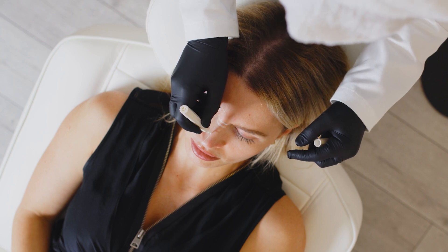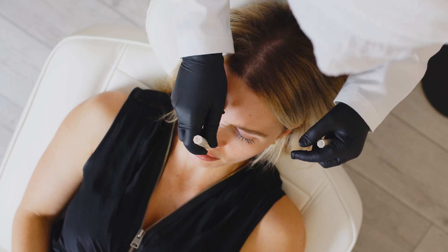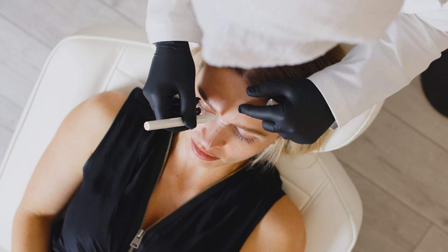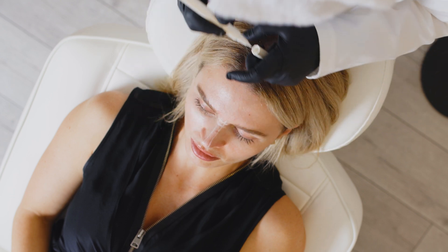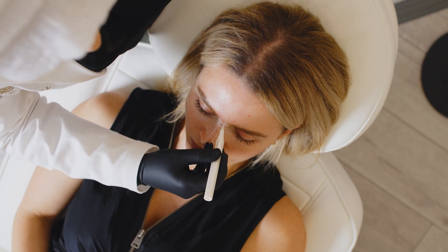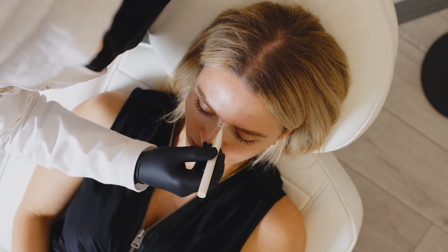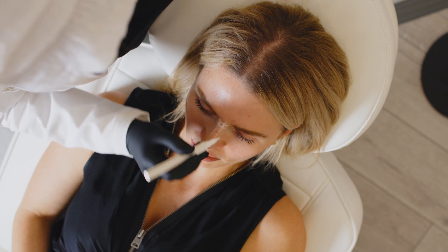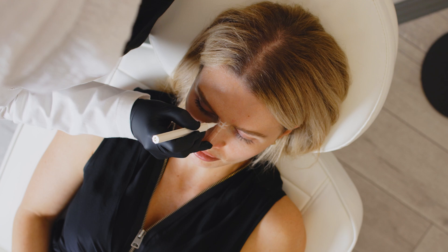There is an ever so slight asymmetry of the nose, which is so common. So I'll be injecting right in the center, making this box as small as possible so that I am very precise in my location, staying away from the lateral aspects. We saw some vessels laterally; we didn't see anything in the midline, so we're going to stay right in the midline.